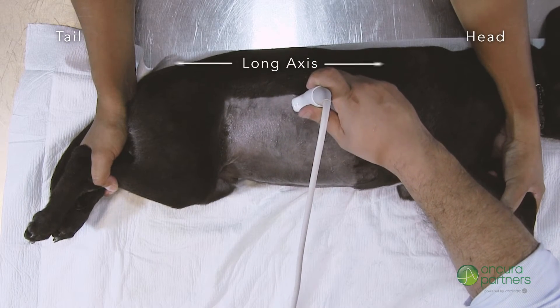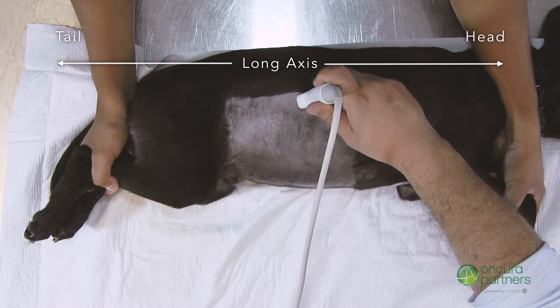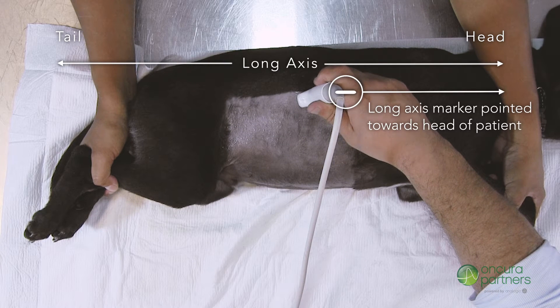For long axis scans, place the transducer caudal to the last right-sided rib dorsally and begin searching for the anatomic landmarks. Ensure the long axis marker is pointed cranially.